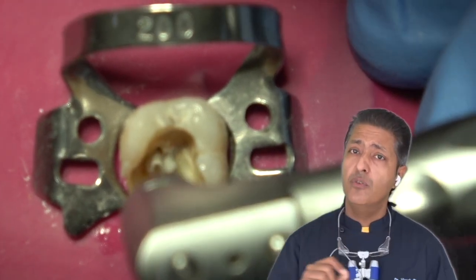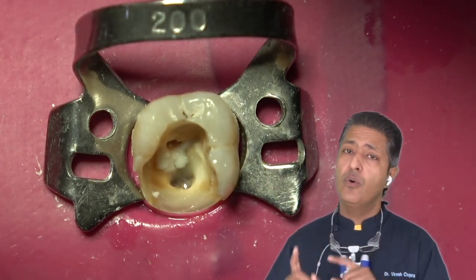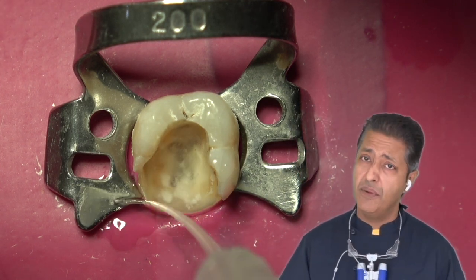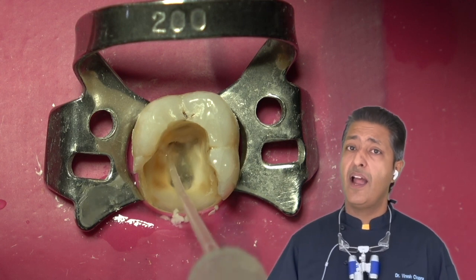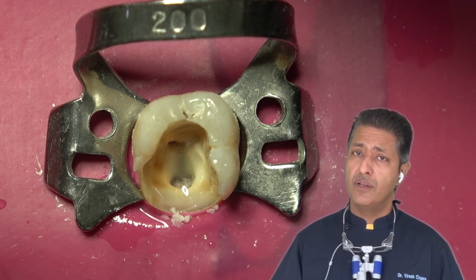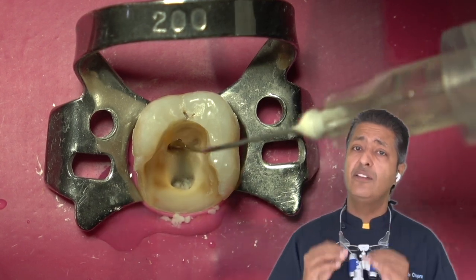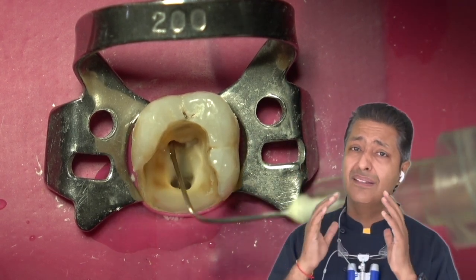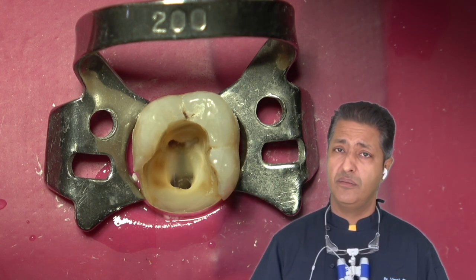Perform only circular movements and inward to outside brushing movements, and once they are done, then we go back to the use of irrigating solution, because this solution will help the bulk of the debris which we have just cut to come out of the canal and not block the remainder of the canal. Once the bulk of the debris is removed, then we can put a 10K file to check the patency. In case the irrigation needle gets blocked, or you feel that the irrigating solution is not going with the same intensity, we can change the needle, which we just saw here, and perform irrigation.